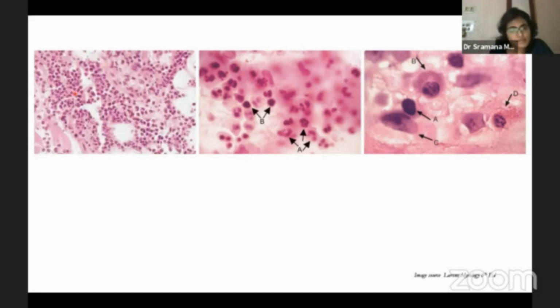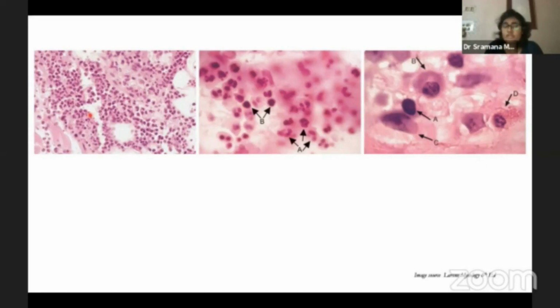Now, if you look at this picture, this is a very common picture that we'll see in biopsy specimens due to certain fungi. You can see a collection of neutrophils. You can see they have multiple lobes. Many of them are degenerating. So when you get kind of pus, liquid pus in the tissue, that's what we call suppuration. So this is suppurative inflammation.